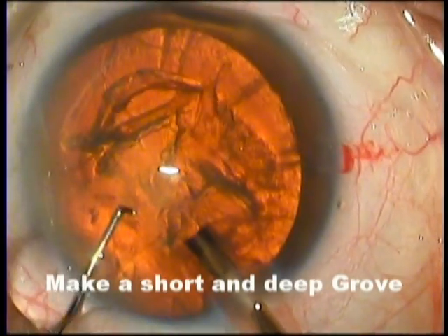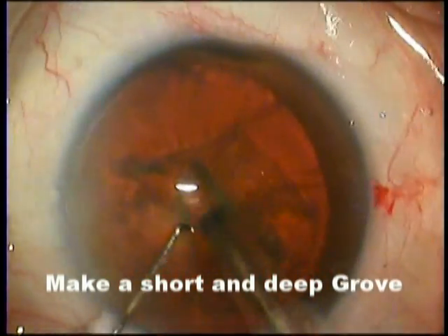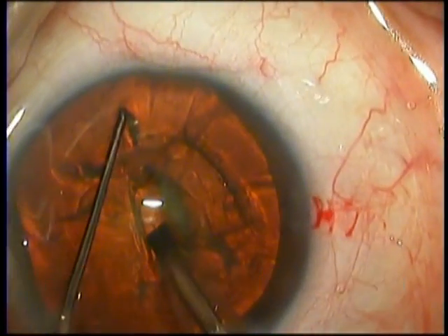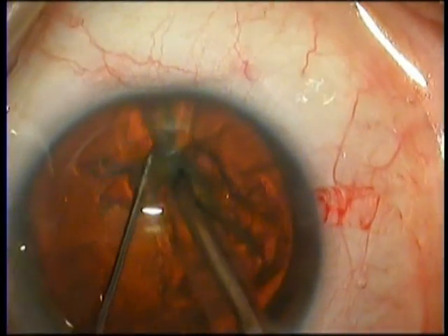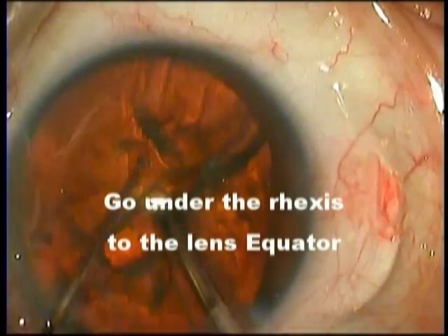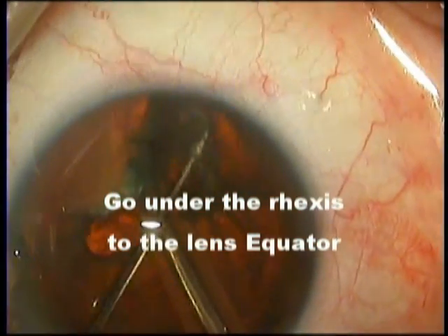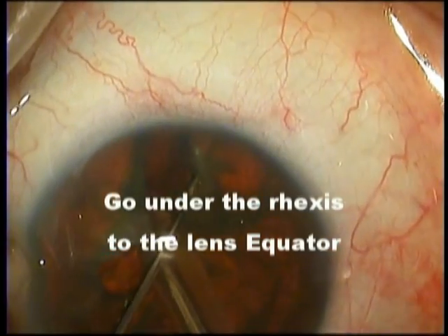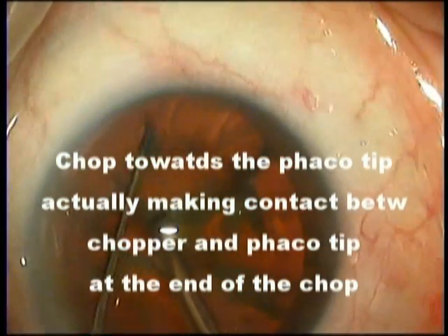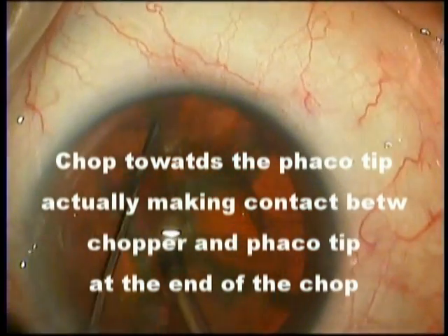My preferred technique of phaco emulsification is to make a small, short, deep central groove. As you can see, it takes just four strokes of the phaco to reach the depth we desire. We go towards the equator, come back towards the phaco tip and separate. Here it is a little daunting to go under the rhexis and towards the equator because the tip of the chopper cannot be visualized. But with a little practice, one gets confidence doing this and it is really the quickest and safest way to chop.